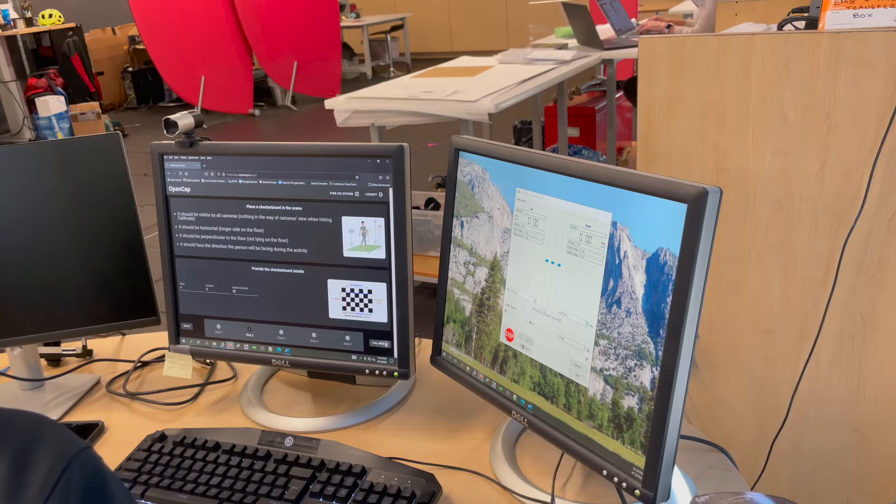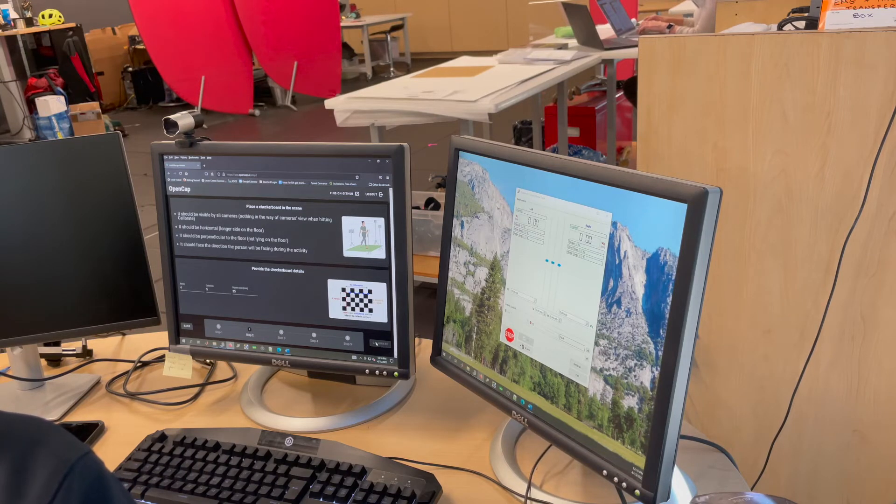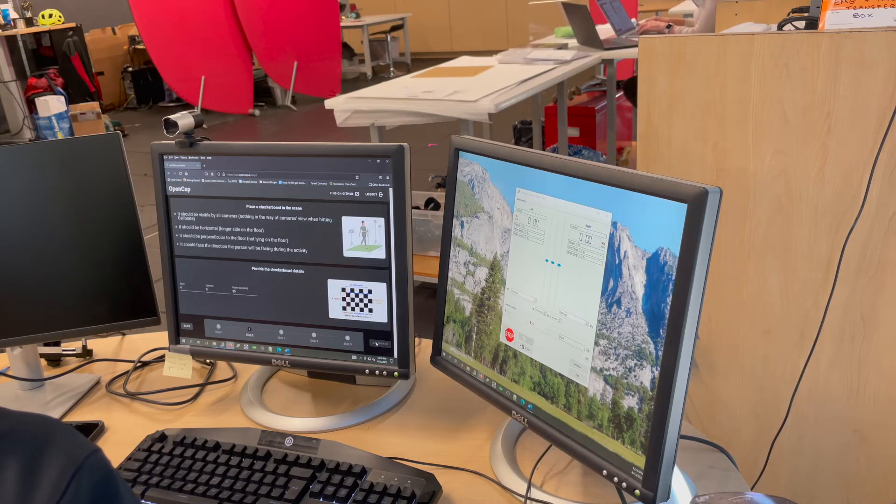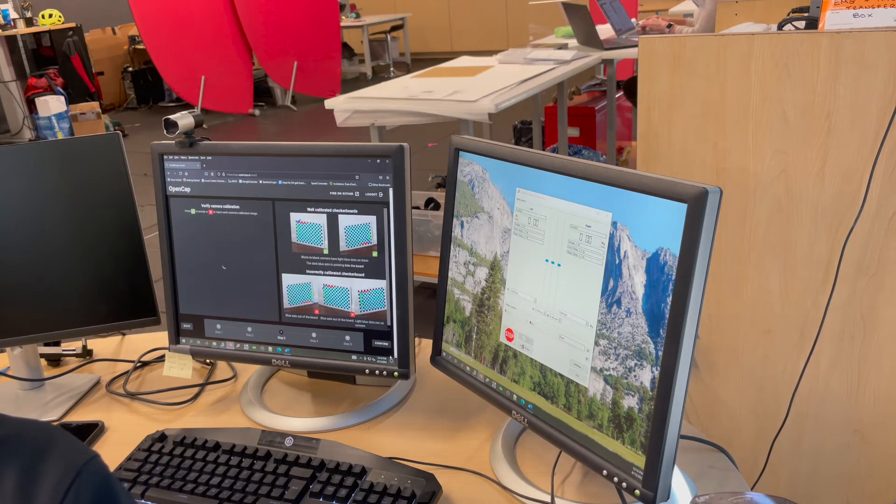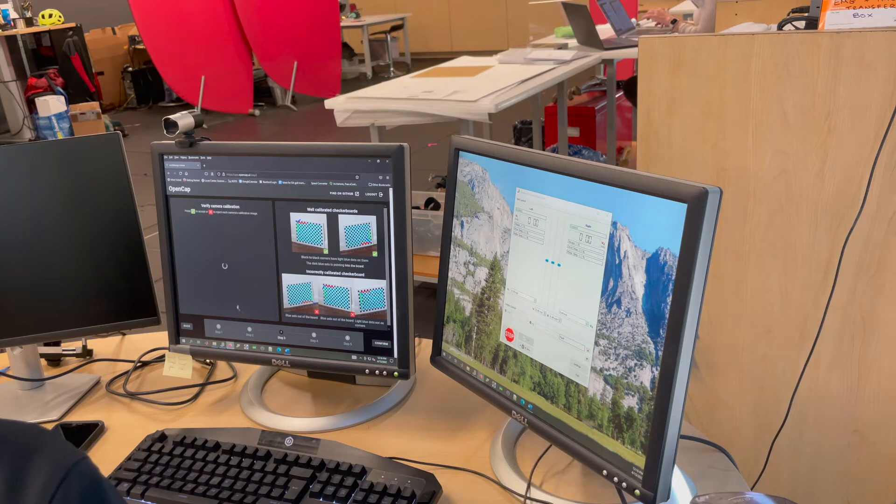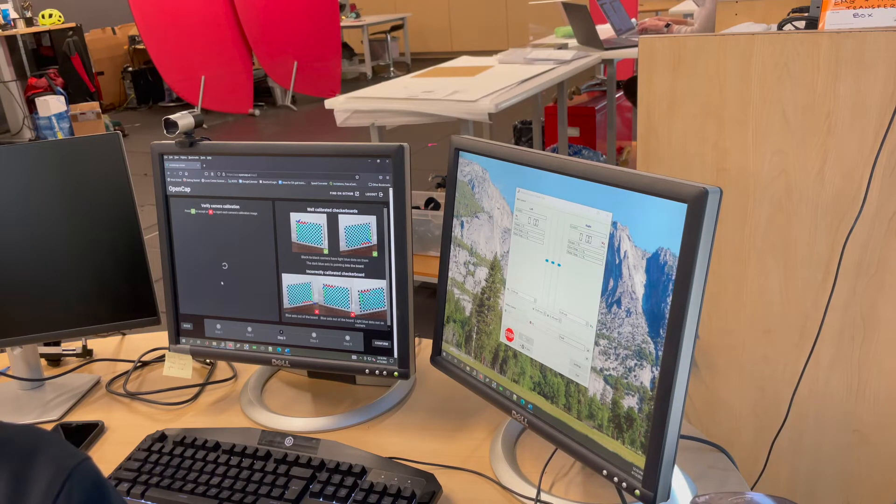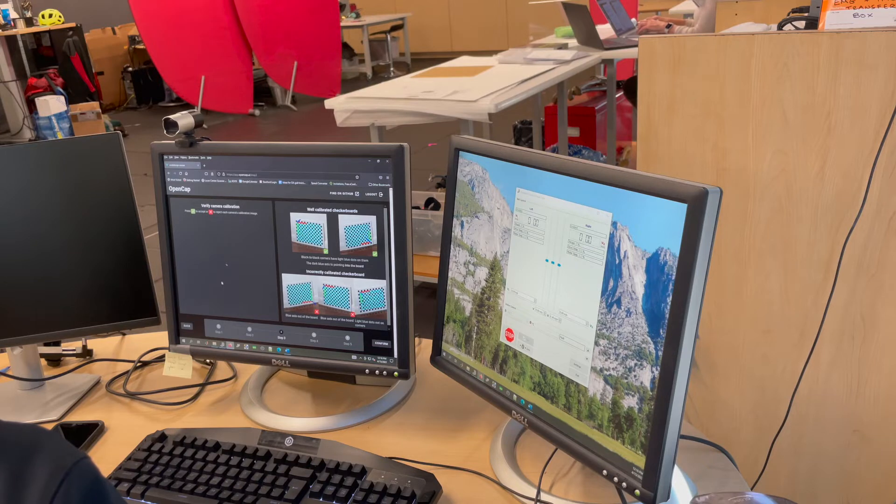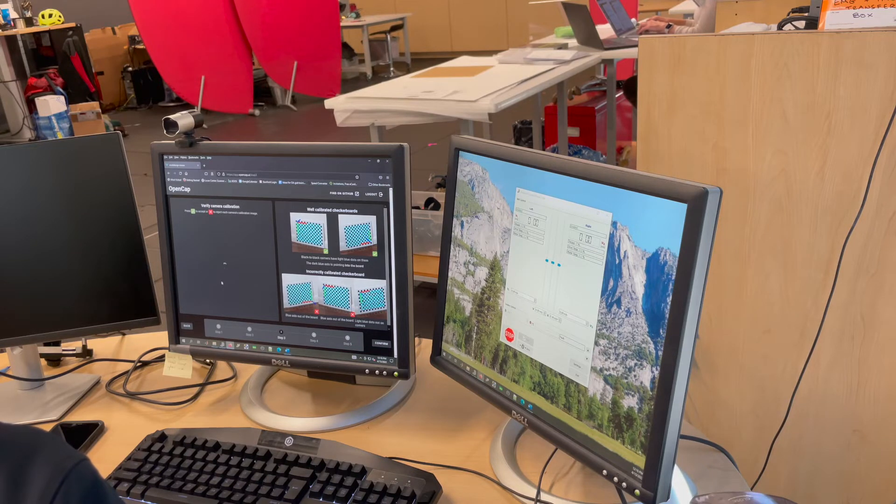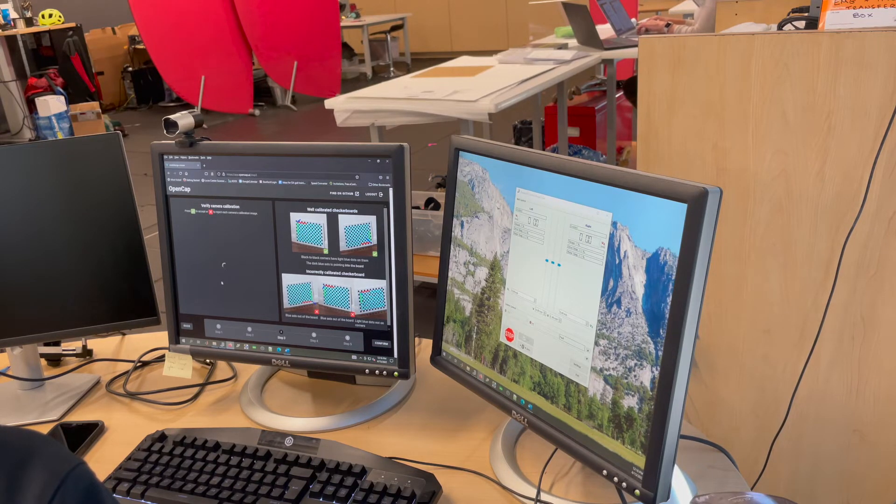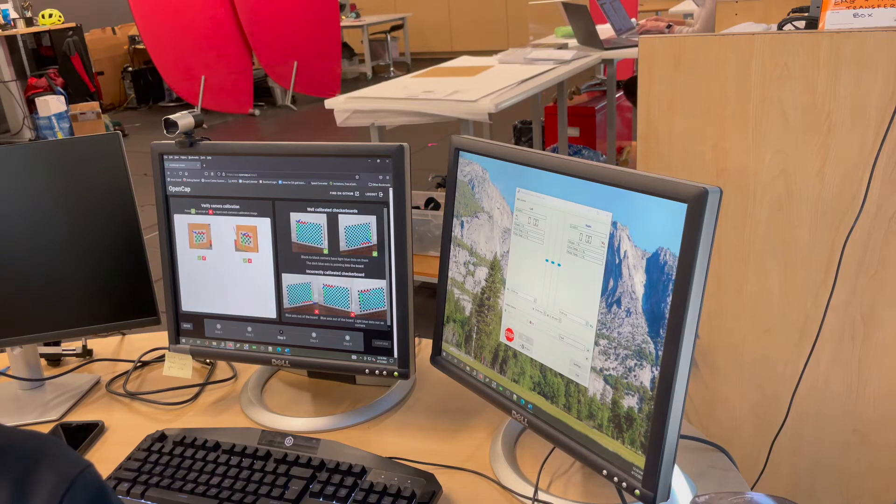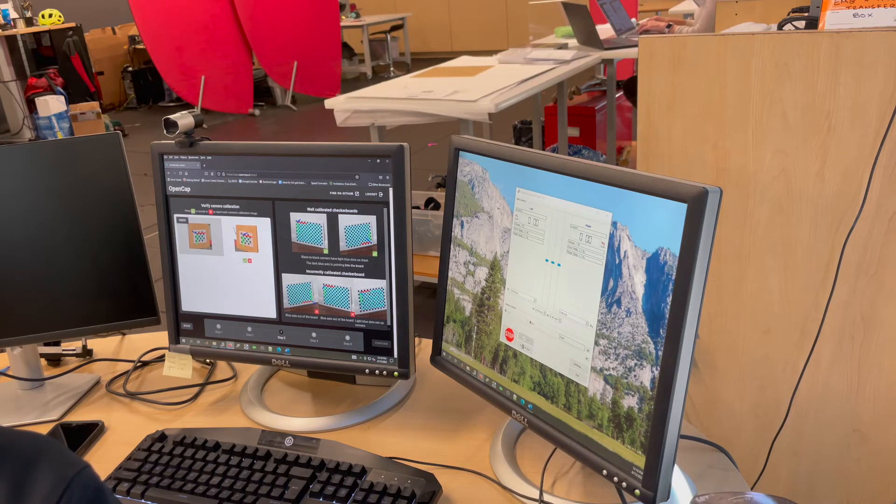Enter the calibration parameters into the web application and click calibrate. For more calibration information, you can view our other videos. You will then be shown the calibration checkerboards, which you can accept or reject based on the information shown on the right. Once you're happy with the calibration, you can press confirm and move on to the scaling step.